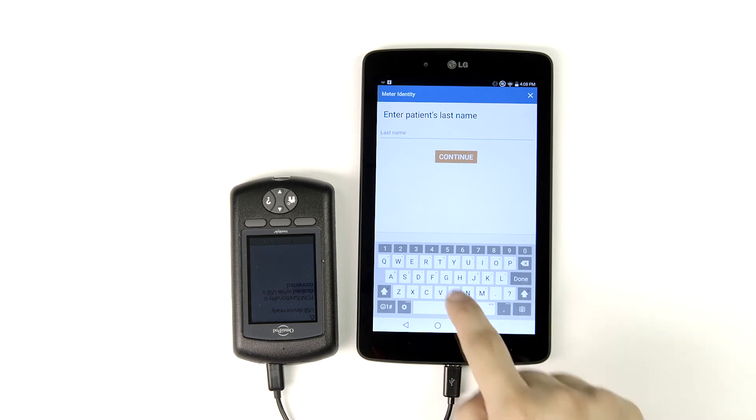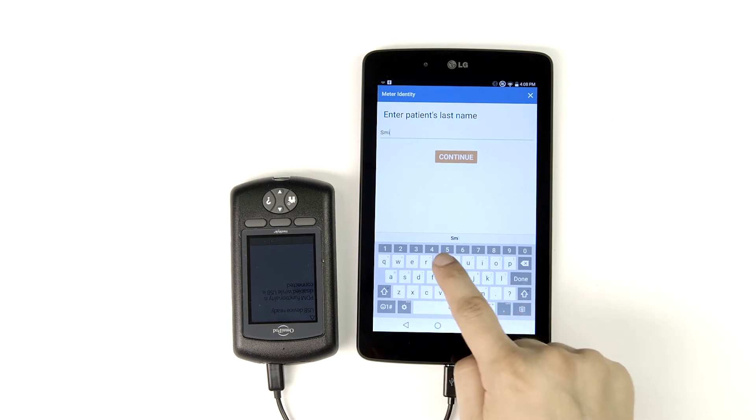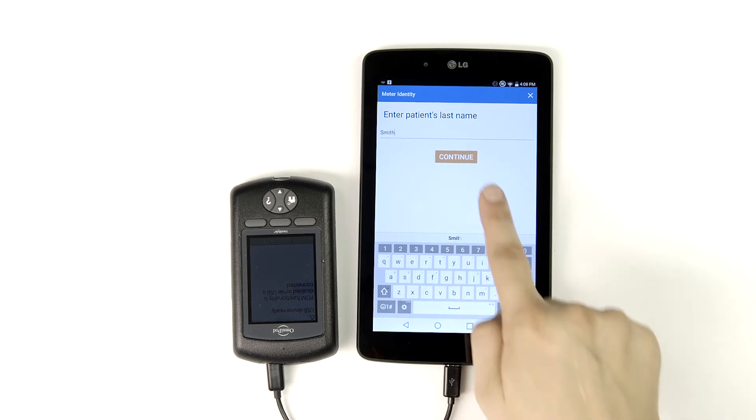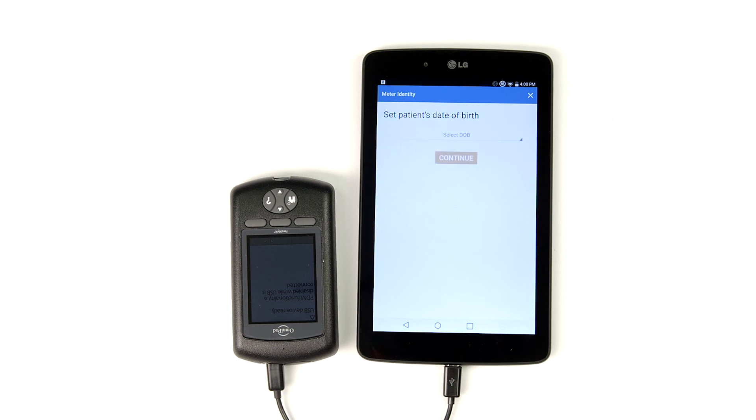Enter your patient's last name and tap continue to go to the date of birth screen.